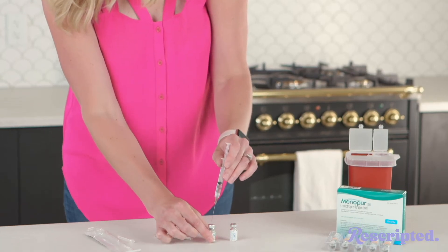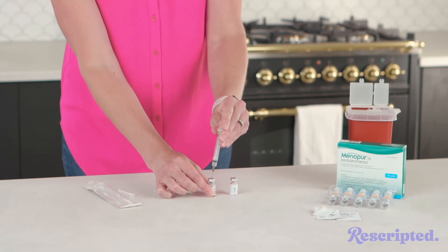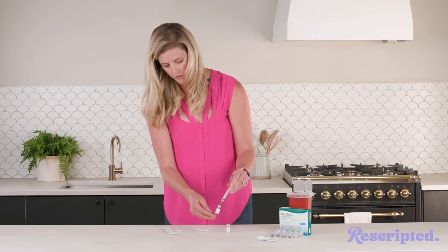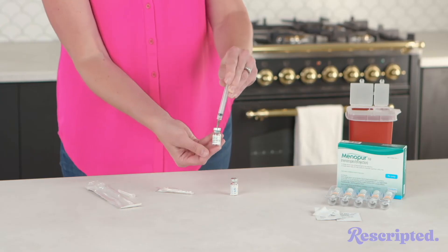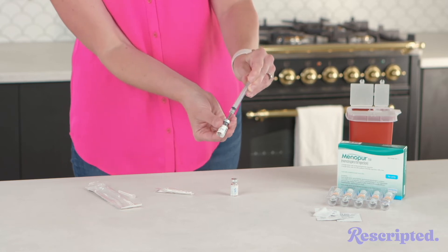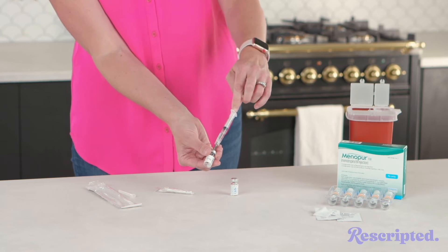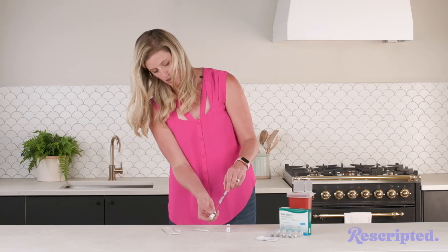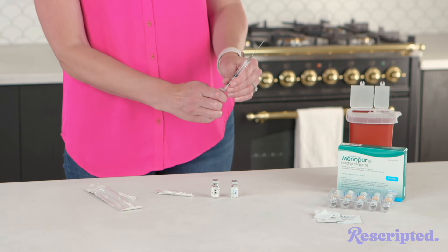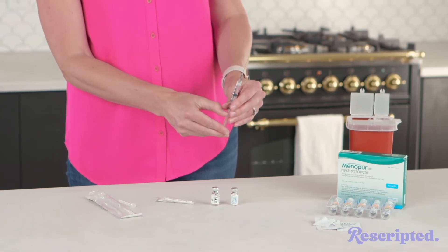You're going to take that and inject that one milliliter of sodium chloride into your powder vial of Menopur. The Menopur should dissolve pretty quickly, but if not, just give it a little swirl and it'll dissolve. Once it's all dissolved, keep that needle all the way at the bottom, tilt it, and make sure the needle's at the bottom of that tilted area, then pull back until all of the medication comes out and you start seeing bubbles. Pull the needle out — you can see you have some air in there. Draw back just a little further to make sure there's nothing in the needle, then push it up until it gets to one.